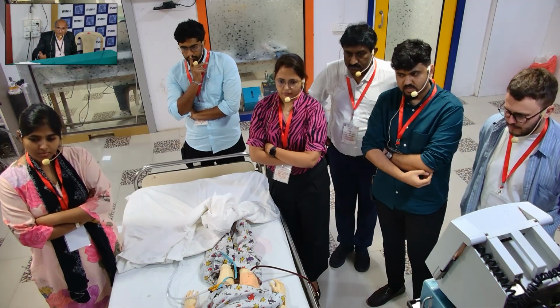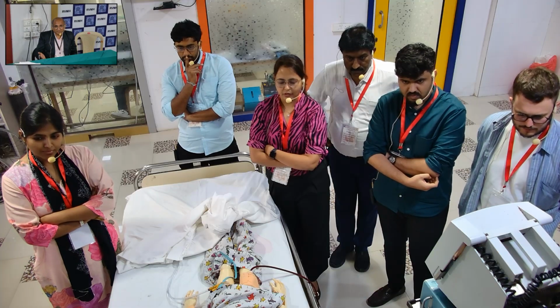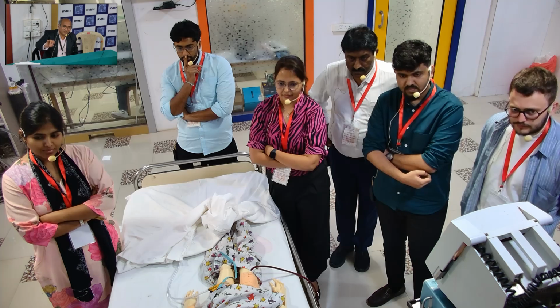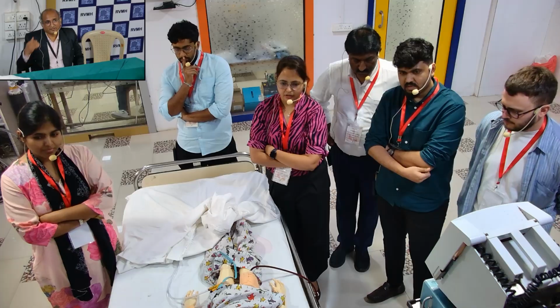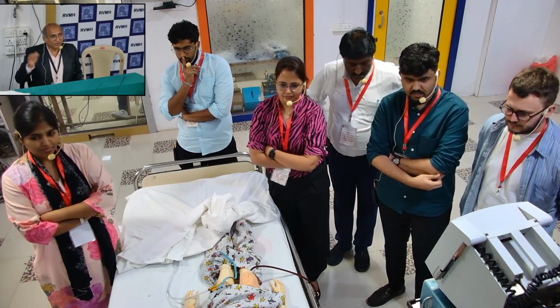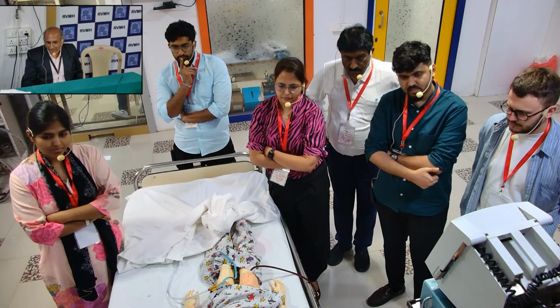You increase the RPM, that can cause cavitation. Luckily, because the tube was kinked, that didn't reflect up to the vessels, and cavitation didn't occur. Later you realized that, and then you came down on the RPM. So that was the right thing you have done at that time.